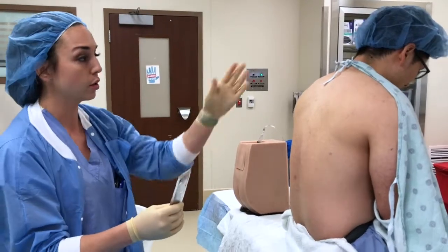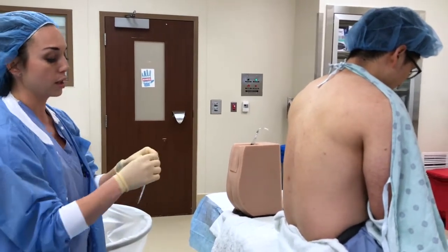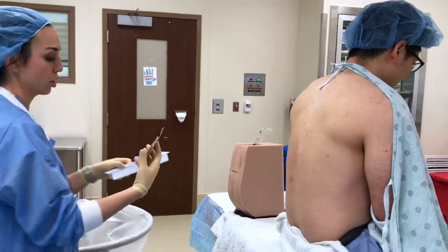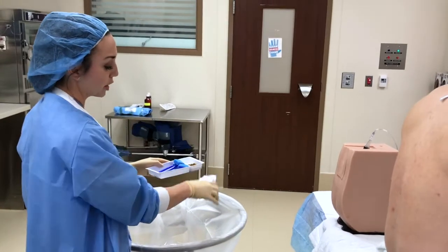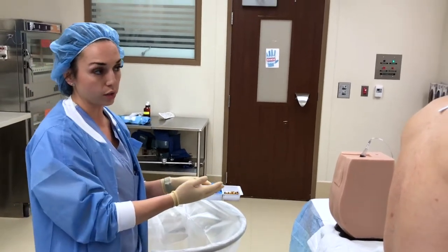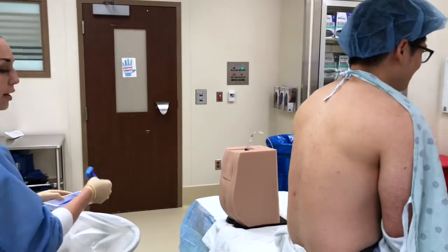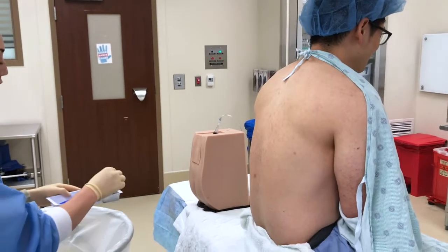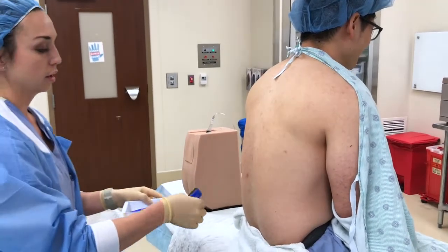So first thing that we do, obviously once the patient is in the proper position, we open our povidone iodine solution. And again, we pour it away from the sterile field because it is neurotoxic and we don't want it to potentially contaminate our field. And then obviously inform your patient before we're applying this cold solution to their back. You say, okay, so I've got some cleaning solution here. It's very cold.